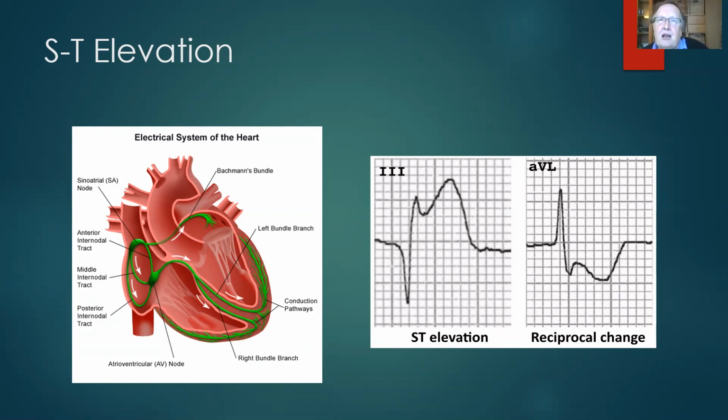If it looks like a duck, it walks like a duck, and it quacks like a duck, it's a duck. Remember, at the end of the day, you're going to take that patient to hospital where they will have blood tests to assess whether the patient's having a heart attack or not. So you're going to take the best option, the safest option. If you see that, don't get too complicated, yeah?